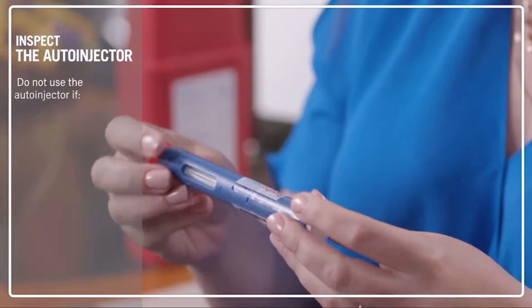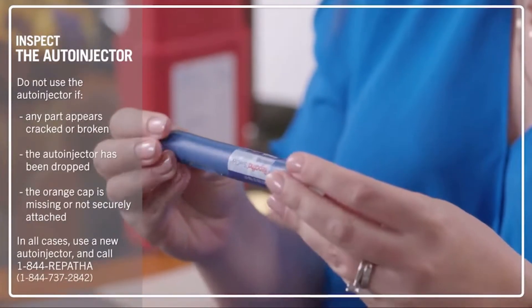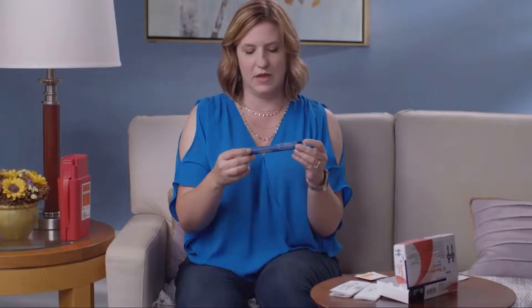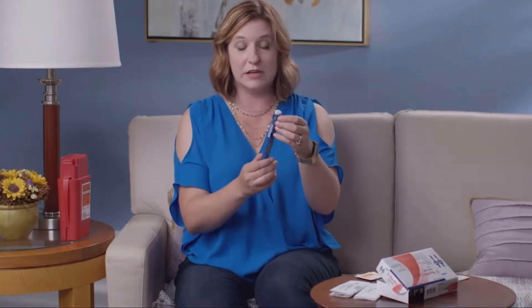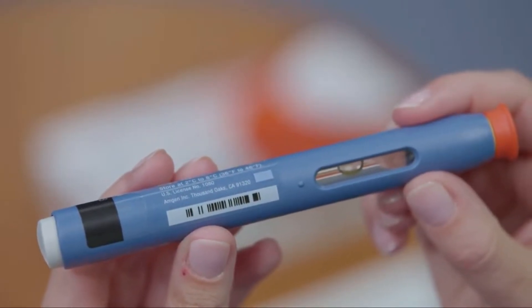Then take a look at the auto-injector for any cracks or breaks. Do not use the auto-injector if any part appears cracked or broken, if it has been dropped, or if the orange cap is missing or not securely attached. Inspect the window to make sure that the fluid is clear. Do not use the auto-injector if the medicine is cloudy, discolored, or contains particles. If it's slightly yellow, that's okay.